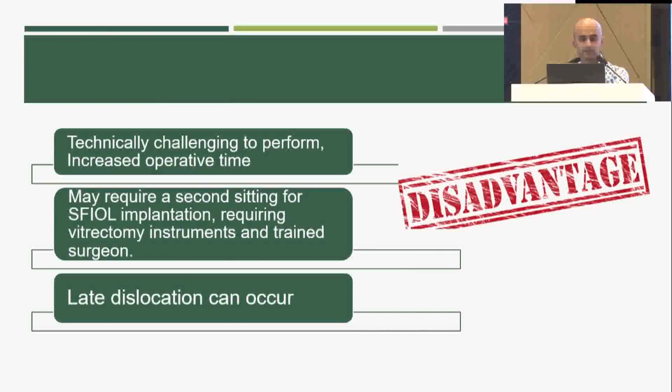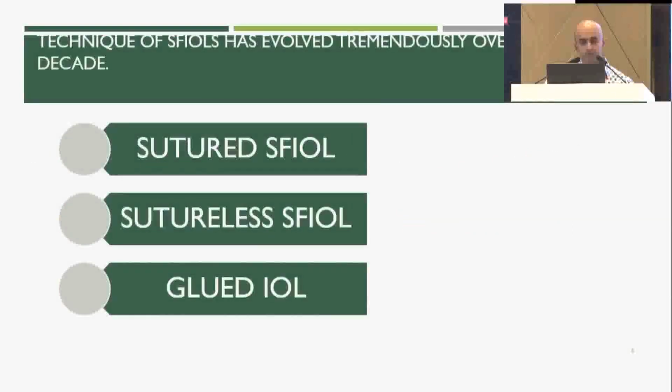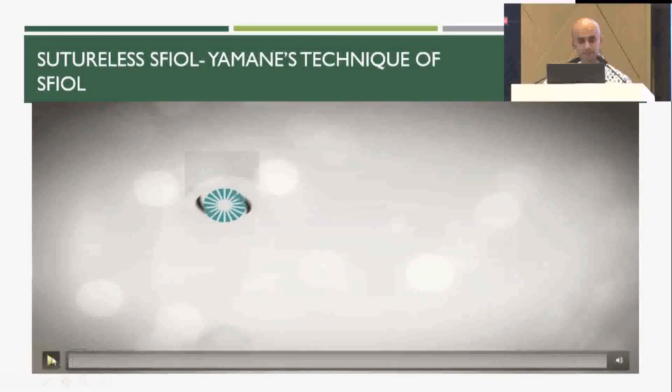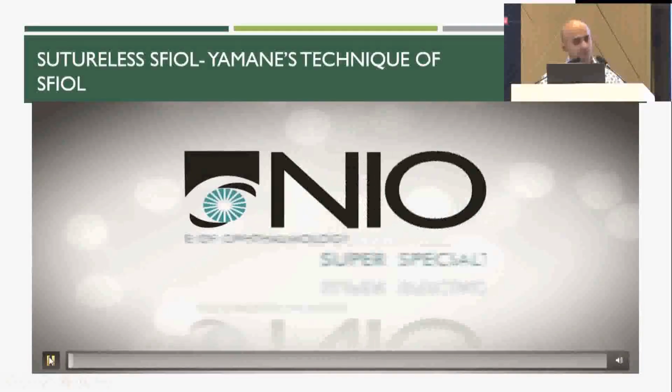Although technically challenging, as I said, it may require a second sitting in some patients where you don't have a planned SFIOL option ready on the table when the situation demands. At the same time, sutured SFIOLs are known to have late dislocation. So the SFIOLs can be broadly classified into sutured, sutureless, and glued IOLs, and I'll be talking about how we do the Yamane's SFIOL.